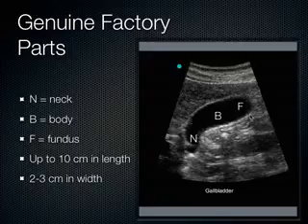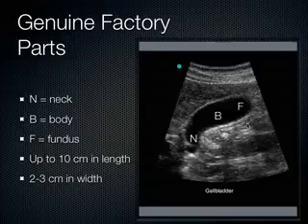Now, posterior to the gallbladder is what organ again? The duodenum. Specifically, we see here that usually it's the second portion of the duodenum, seen just behind the posterior gallbladder wall. And what's this right here? It's inside the lumen of the duodenum. Air. So air looks like this. Air, as I mentioned, can sometimes cast a dark shadow or a bright shadow. It's variable. And so, doesn't it look almost like a stone with a shadow behind it?